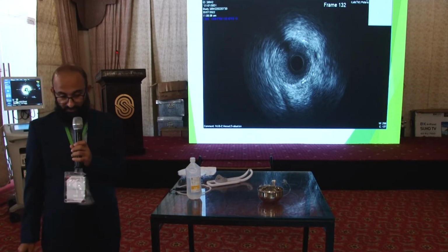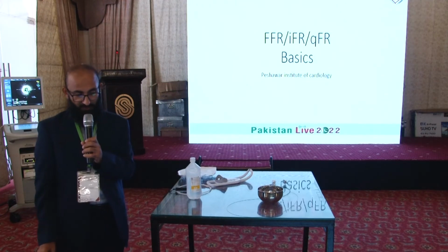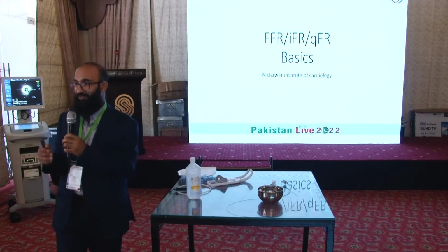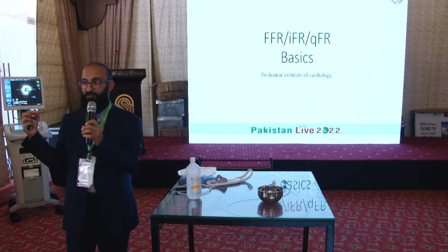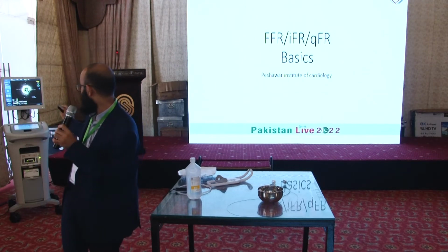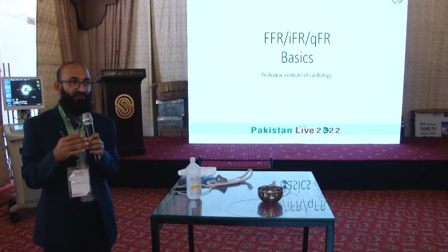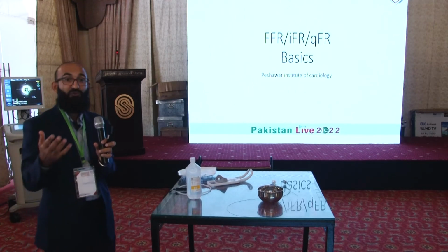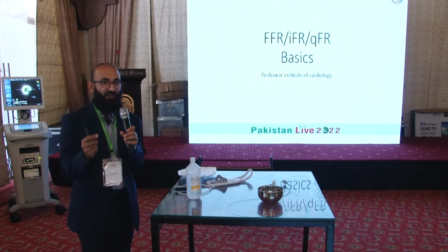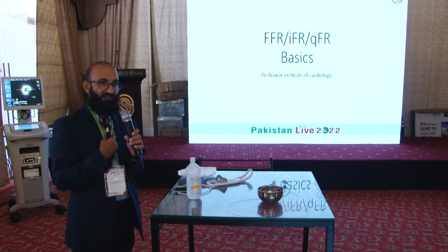One very interesting case was we did IVUS as well as physiology, so I want to show that. Now in this, Abdal is here, so these tools, as I have already mentioned, are very important. And another part which this machine has is physiology. Physiology is very important because why do we treat the coronary artery? Because we treat the coronary arteries when the myocardium is ischemic and it is causing pain.